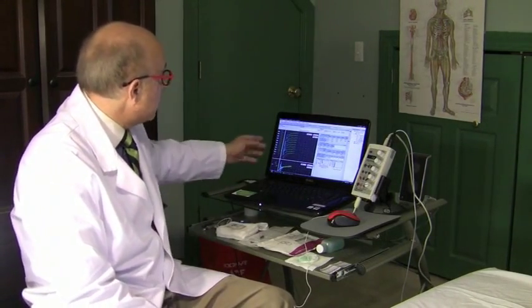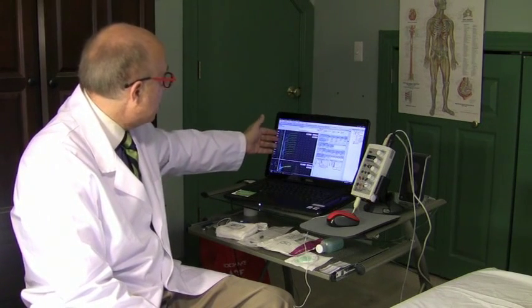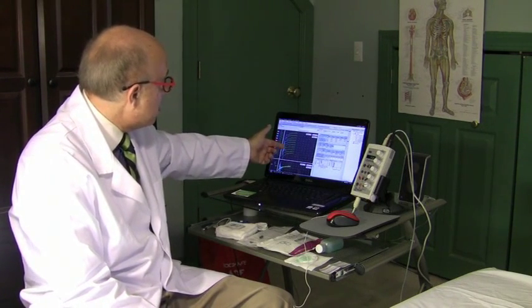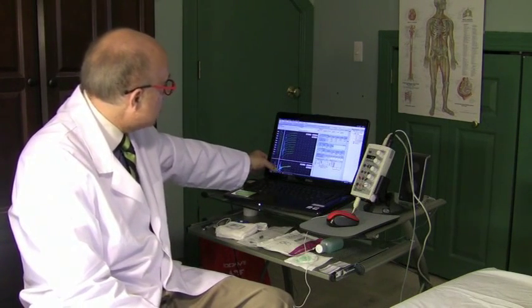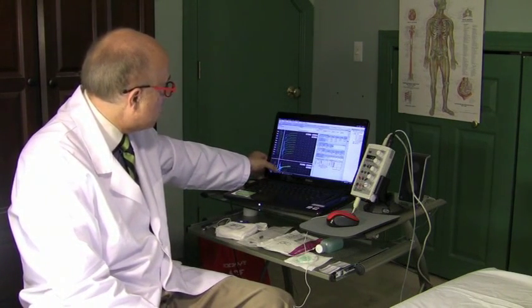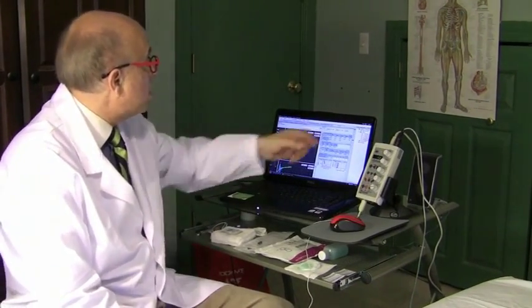So again, the F wave is coming from the neck. On the left side, you're seeing what's coming from the wrist. On the right side, you're seeing what's coming from the neck. When we superimpose them, we can see which one is the earliest one and which one is the latest one. That's why we superimpose them, and the computer measures that automatically and tells us what it is.